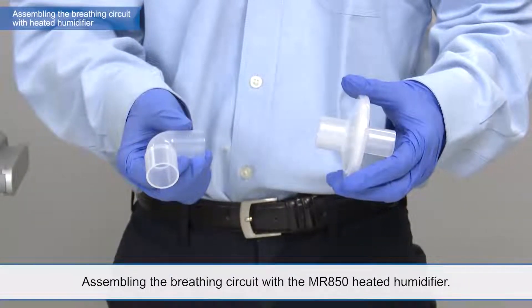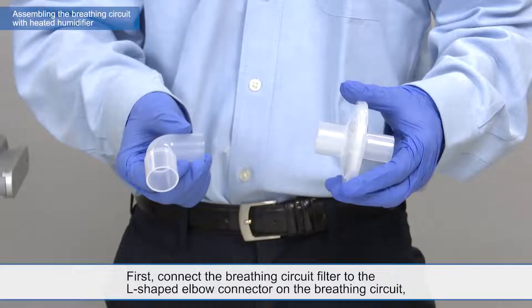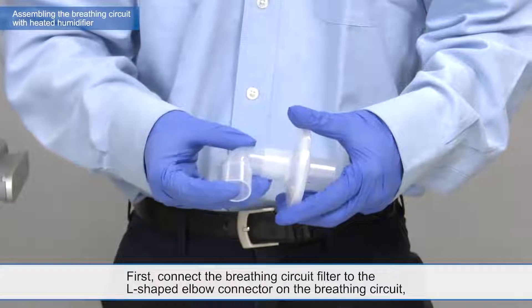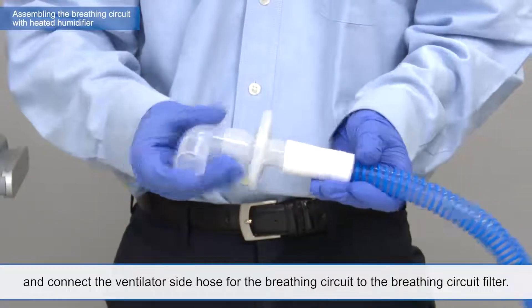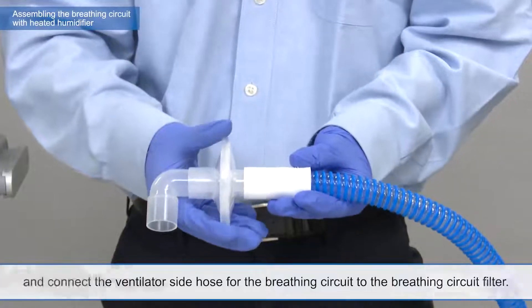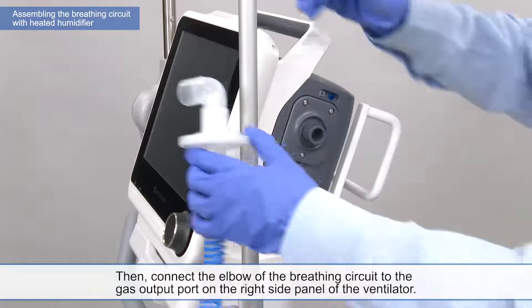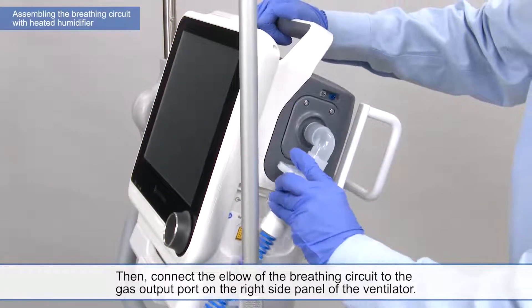Assembling the breathing circuit with the MR850 heated humidifier. First, connect the breathing circuit filter to the L-shaped elbow connector on the breathing circuit. And connect the ventilator side hose for the breathing circuit to the breathing circuit filter. Then, connect the elbow of the breathing circuit to the gas output port on the right side panel of the ventilator.